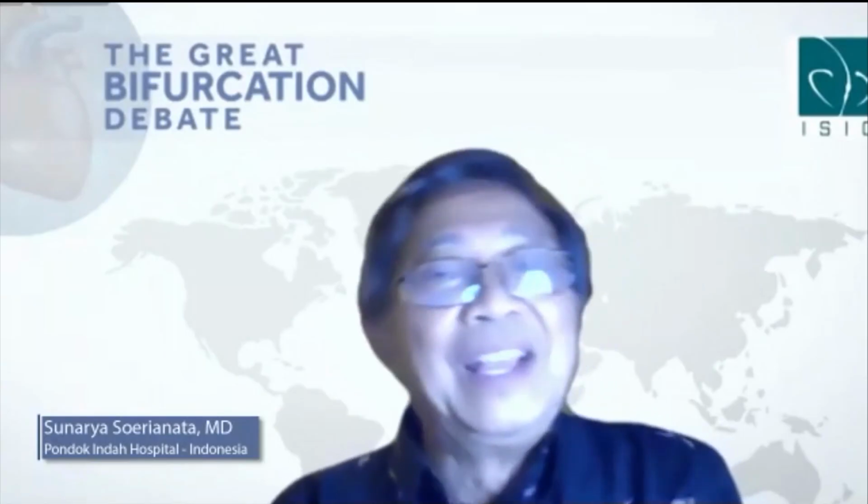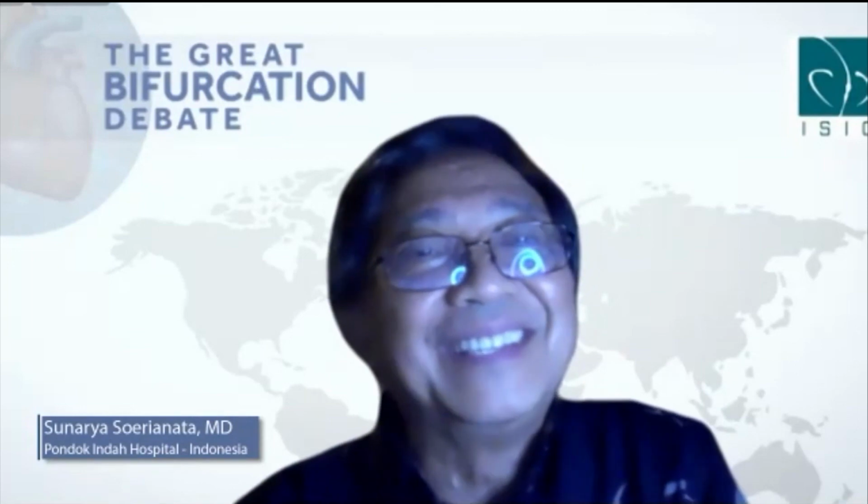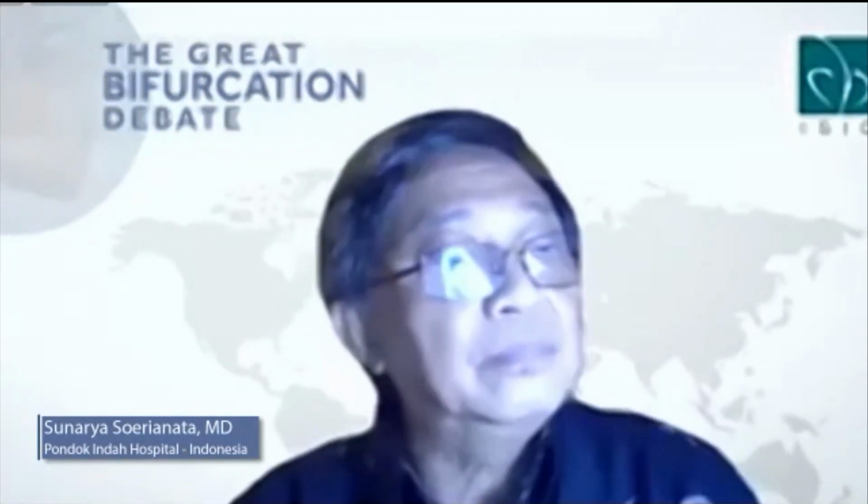Thank you. So I think, Professor Goram, do you have the last word on this case? Yeah, there is one small technical detail that I would like to congratulate as well. After stenting the LAD, Dr. Munawar used a 4.0 balloon inside the 3.5 stent up to the point of the diagonal. So this was also POT for the diagonal vessel, explaining how carefully he performed this intervention step by step.